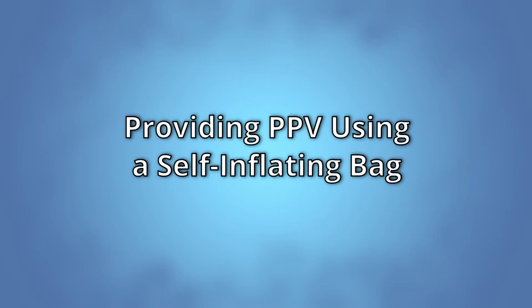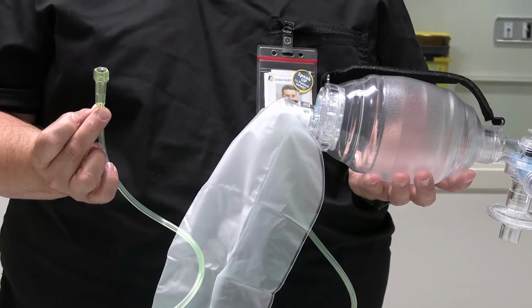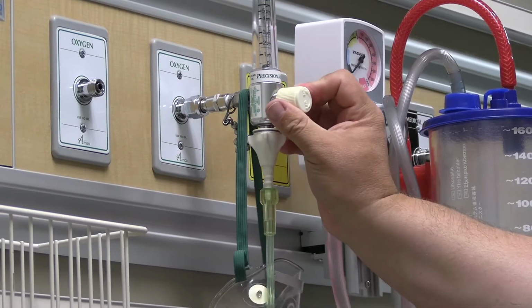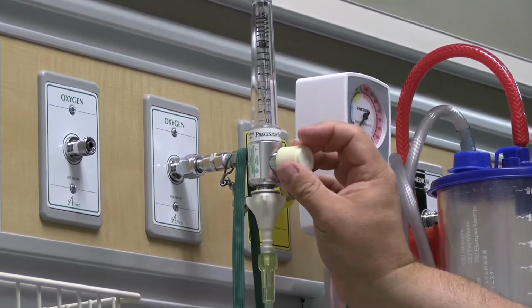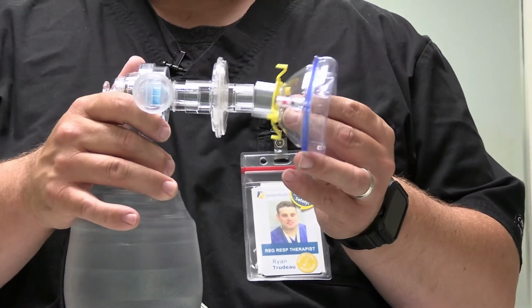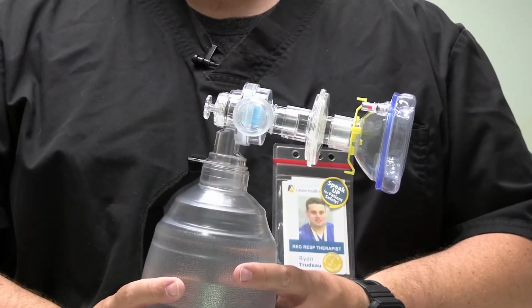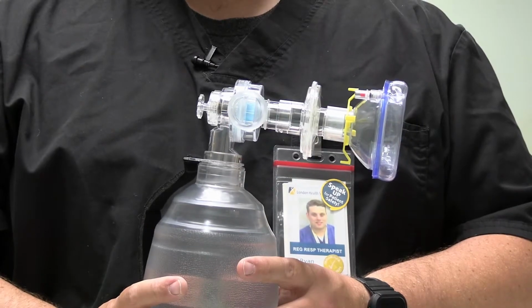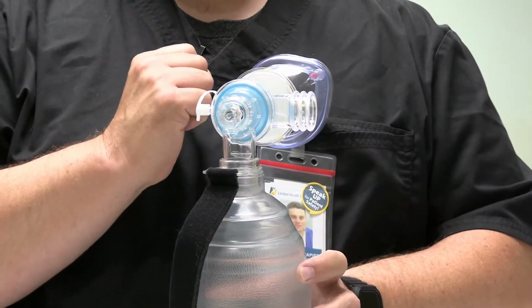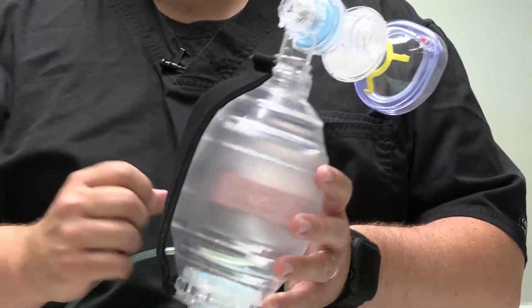We're now going to use the self-inflating bag on our patient. We are going to take our end of our oxygen tubing and attach that to the flow meter on the wall. We are going to turn our flow up to 10 liters per minute. You're going to take your mask and attach it to your bag, just like so. Make sure your connections are nice and tight so they don't come apart as you're providing ventilation for your patient. You also have the ability on this port right here to attach a PEEP valve if you needed one right there, okay, to set a PEEP level higher than 5.